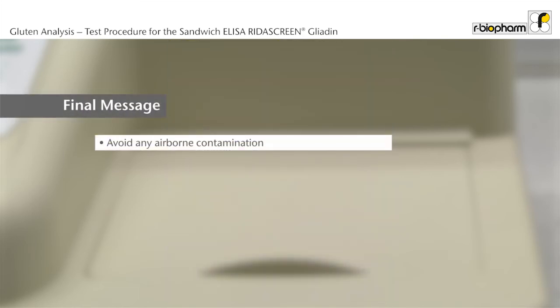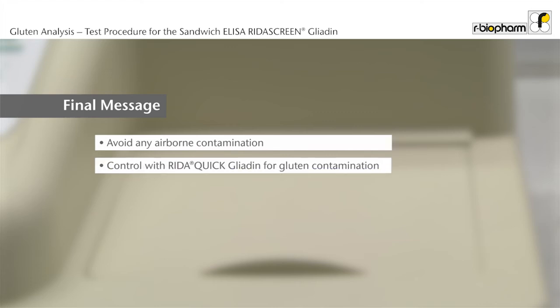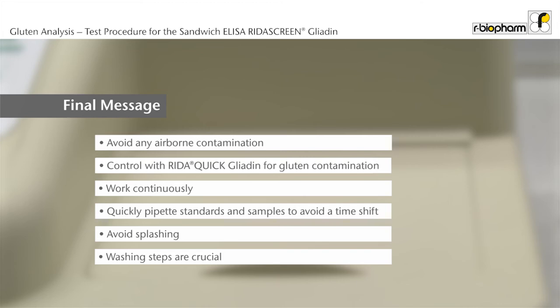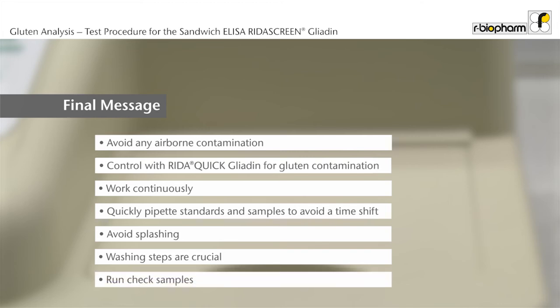Avoid any airborne contamination from cereals; keep windows closed. Control with RIDA Quick for gluten contamination. Have a continuous workflow during the assay procedure. Please notice that the reaction starts with the addition of the first standard or sample to the plate; therefore, standards and samples should be added quickly to the plate to avoid a time shift. Avoid splashing. Washing steps are crucial and have to be carried out thoroughly. Run check samples, for example R7012 with known concentrations, for quality control.